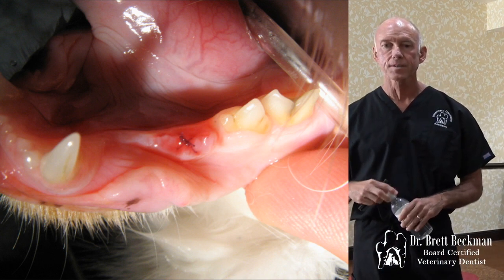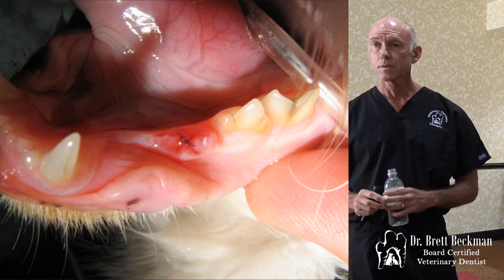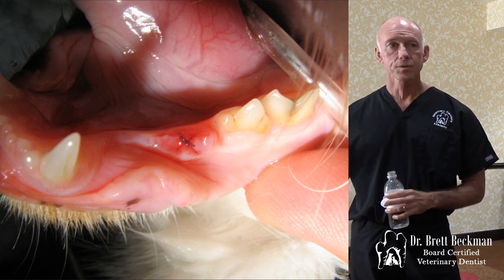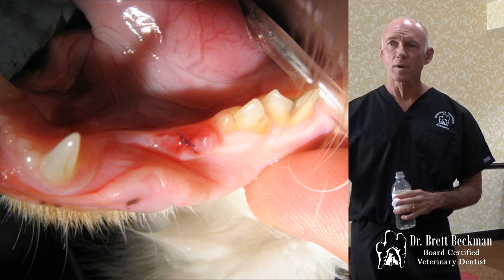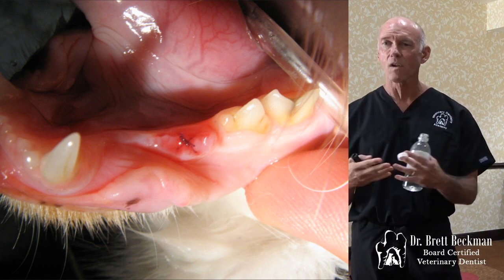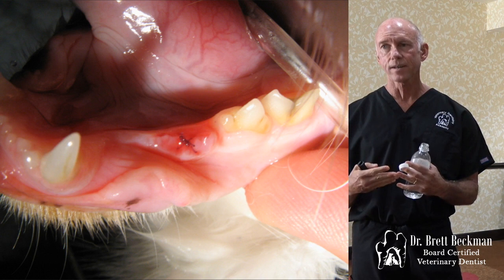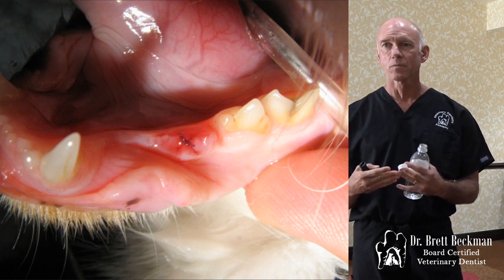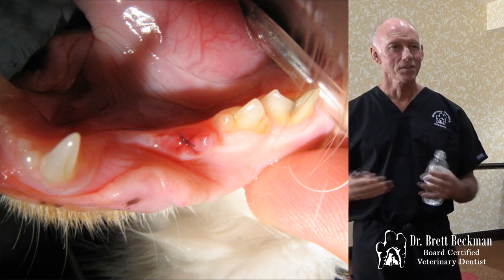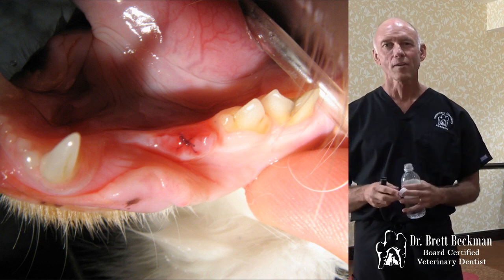When we're making decisions on this, we also have to take into consideration the tissue. Sometimes you'll have tissue that's really inflamed there, and you don't want to do our marginal excision like we do for the quadrant, because that's a small area. It's hard to get that back up. So you want to leave that inflamed tissue there too. You don't want to get aggressive, just let it heal. Eventually it will do fine. We don't like to suture inflamed tissue to inflamed tissue, just from personal reasons, right? We want it to be all nice and look good, but we don't always have that option.